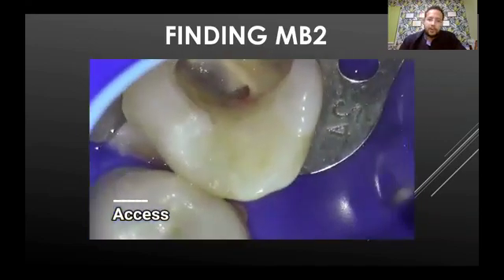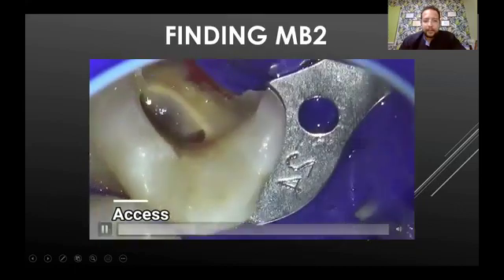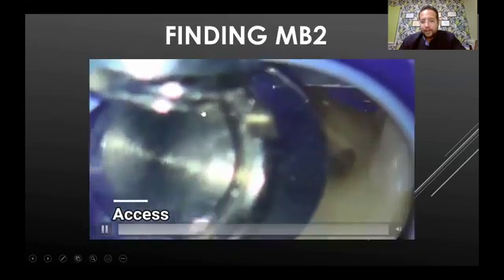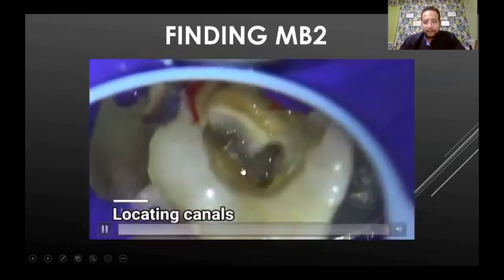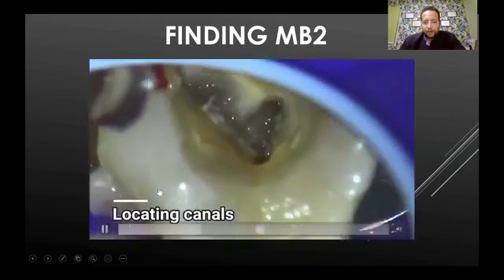Look, I opened from the exposure. Look how much dentine is saved at the mesial. I still didn't see the mesial canal. This is the distal, this is palatal, and I'm still not exposing the mesial. Here I expose the mesial canal. As we see the distal caries, I preserve all the mesial dentine here.